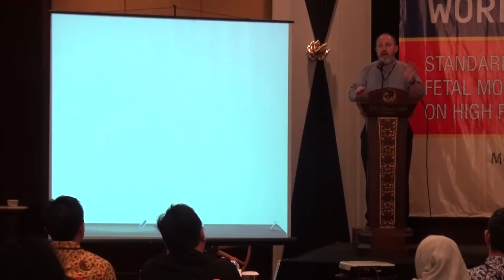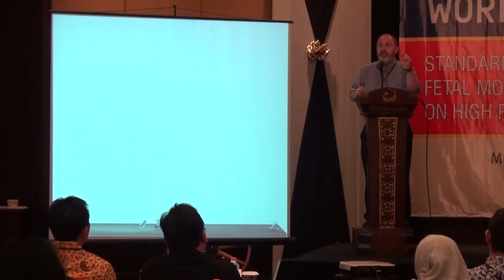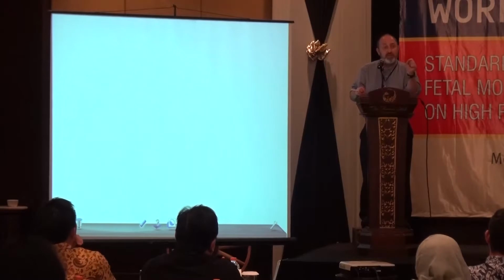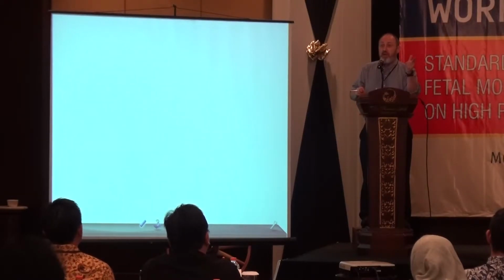If the deceleration pattern, not just the one deceleration, if the overall pattern shows abrupt onset and rapid recovery, the pattern is variable decelerations, irrespective of where during the contraction phase it occurs, including if it occurs with the deceleration. Does that make sense? If the overall pattern is gradual onset and gradual recovery, then it must be earlys or lates. And now you need to look at the contractions to determine which it is.